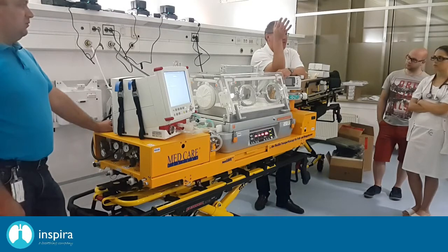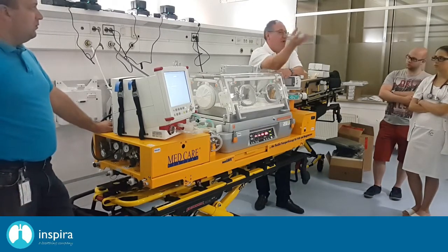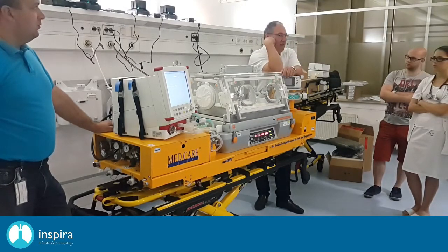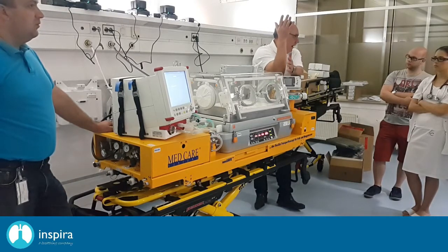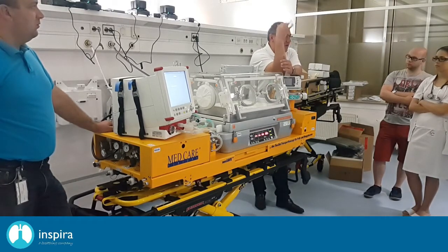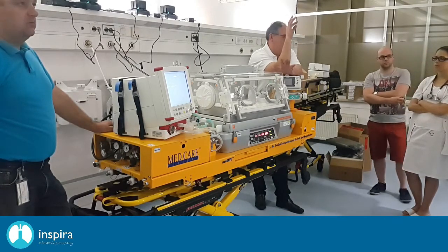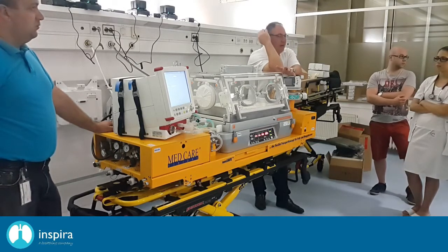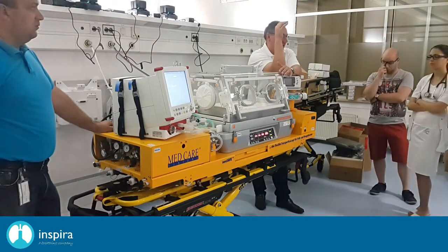For sure, if you have to take a decision as a doctor, and if you are picking up babies from a local hospital, and if you have twins there, and the second twin won't survive until you are back with a transport system, you can put also twins inside, but it's only an ultima ratio decision, okay? It's very important that you don't do it on a normal basis, okay? And if you do so, please do a documentation, okay?